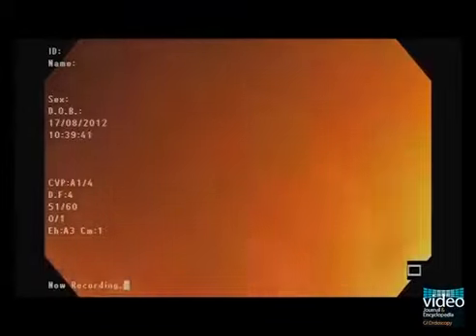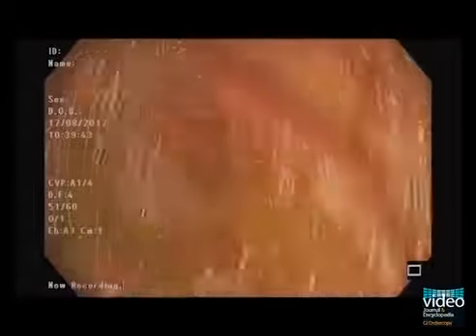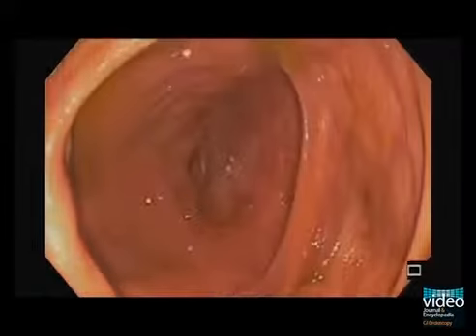The pole of the cecum, often contaminated with bowel content, when cleaned may reveal the triradiate fold, which is the fusion point of the 3 taeniae coli. The appendix orifice is noted. The ileocecal valve is located at the medial or posterior medial wall. An arrow drawn on the bow of the appendiceal orifice will usually point to the ICV orifice.